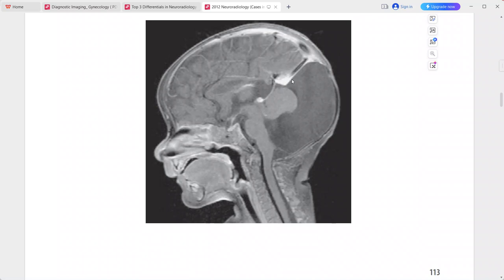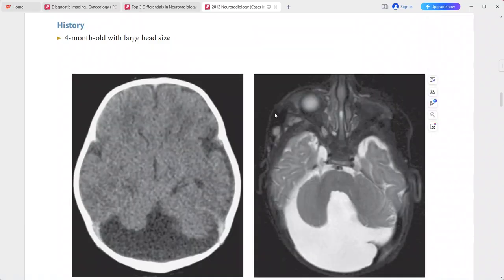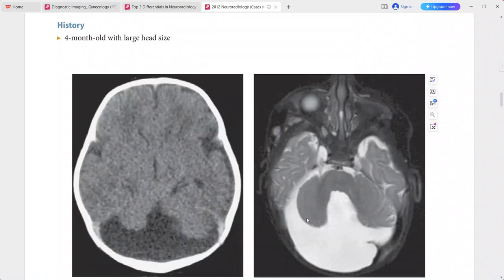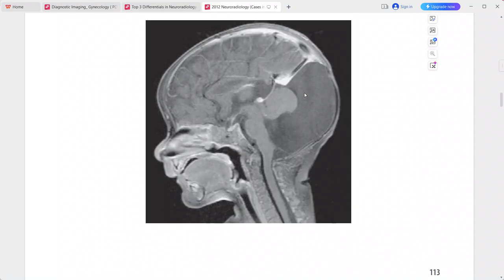The cerebellar vermis is severely hypoplastic, the cerebellum is rotated upwards, and the cerebellar hemispheres are small. This is a typical presentation of Dandy-Walker malformation.